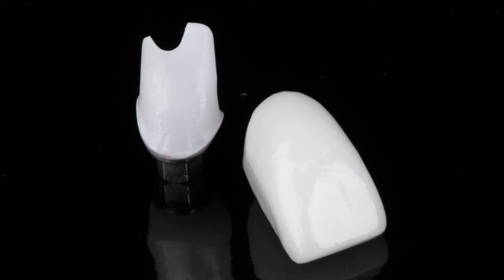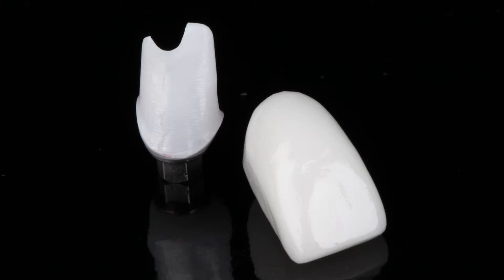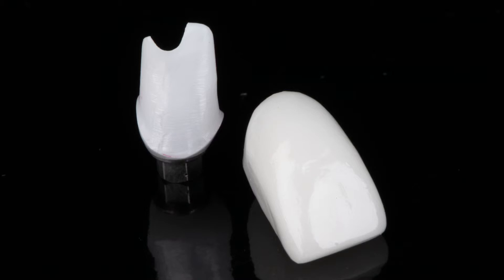In figure 4, we see that following my approval of the virtual restorative design, which was constructed to mirror the aesthetics of the contralateral lateral incisor, the zirconia abutment with titanium base was fabricated along with the implant retained crown.